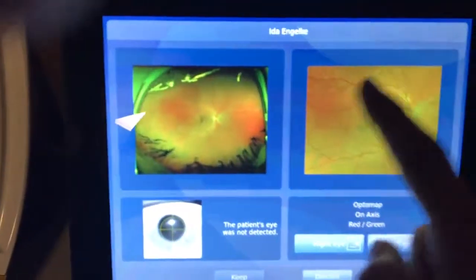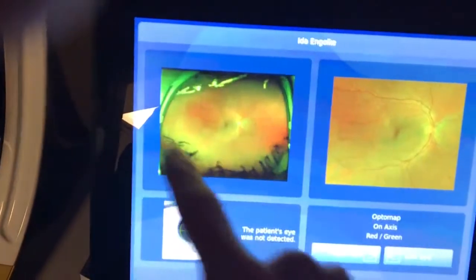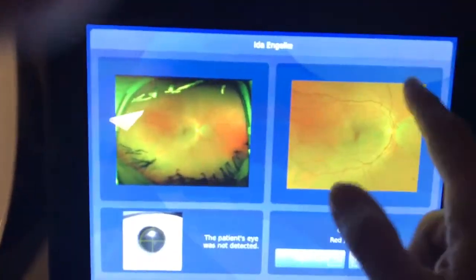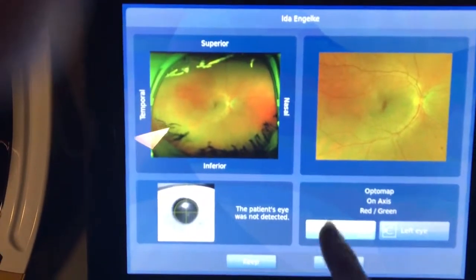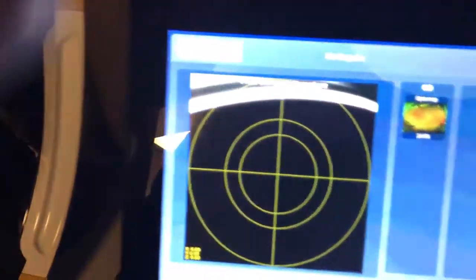Good, you can sit back. So if you get a good picture, you don't have a whole lot of eyelids or eyelashes in here, and that's good — that's a good picture. So we're going to do right eye, keep, and now it's ready for the left eye.